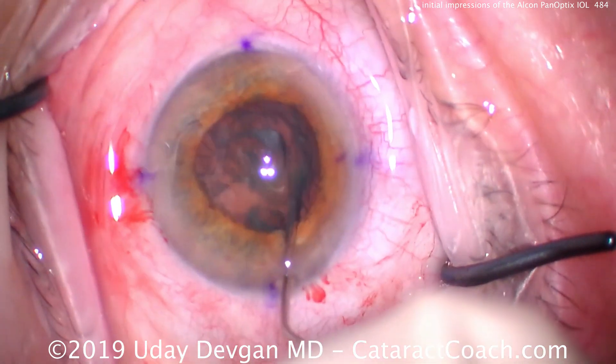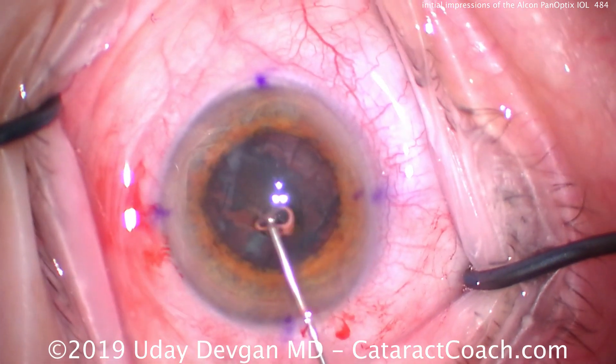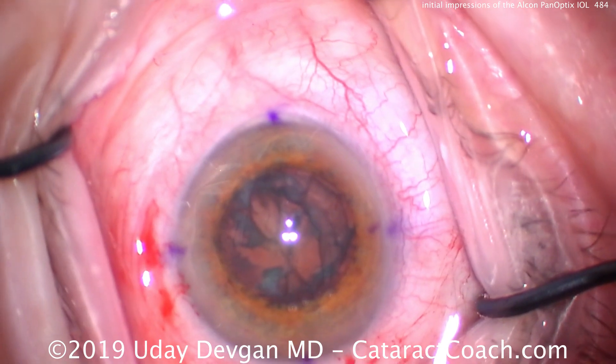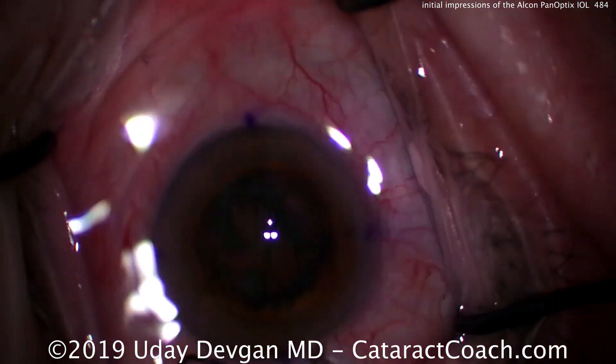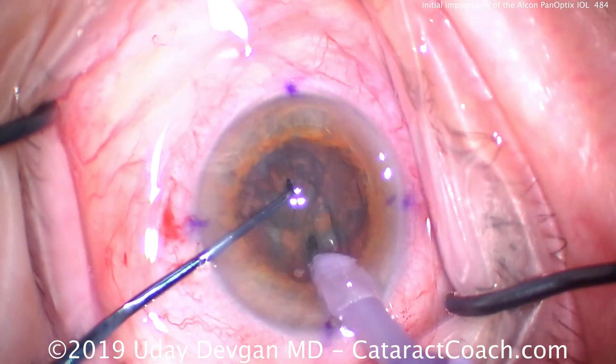It's still not the fountain of youth — it was never promised as such — but we as surgeons have to make sure that patients understand that as well. These patients look to us for guidance. Here we can do a quick phaco chop and we'll fast forward to the end of the case.